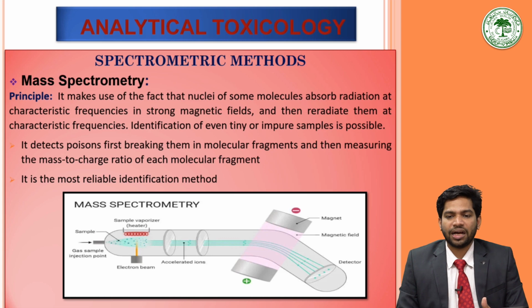Other methods for the ionization of the samples can be chemical ionization. Accordingly, the name could be chemical ionization mass spectrometry, done by chemical means with the ions of a reagent gas, usually methane, ammonia, and isobutane. Then another technique could be electrospray ionization mass spectrometry, that is ESI-MS.